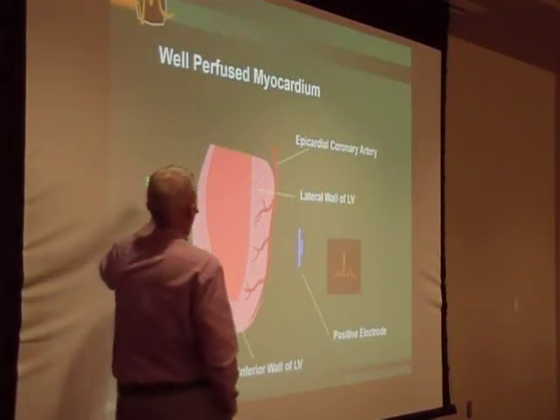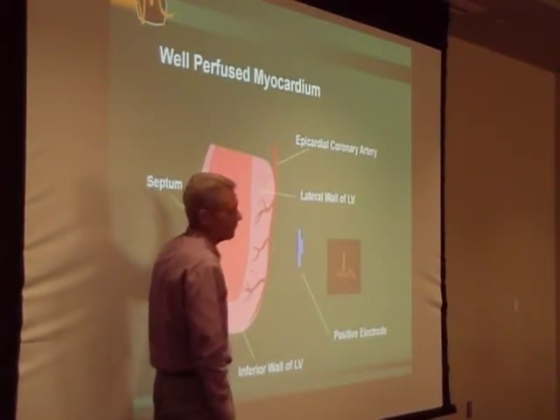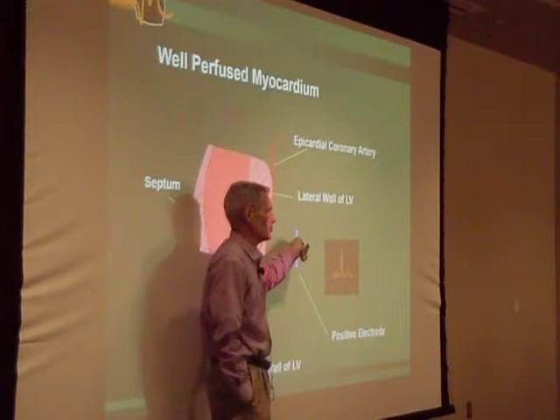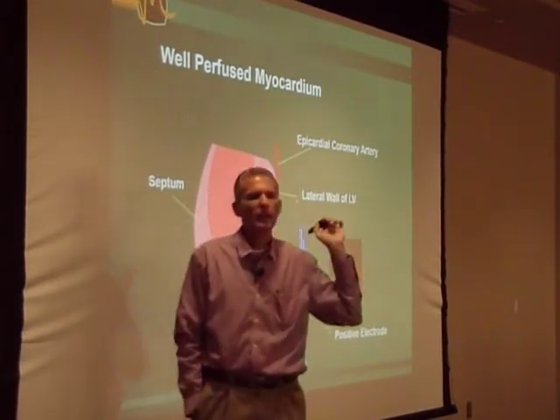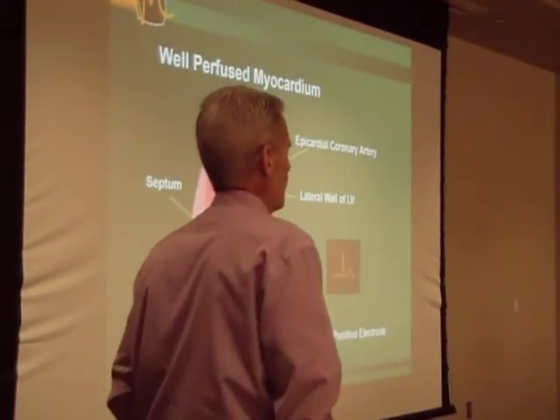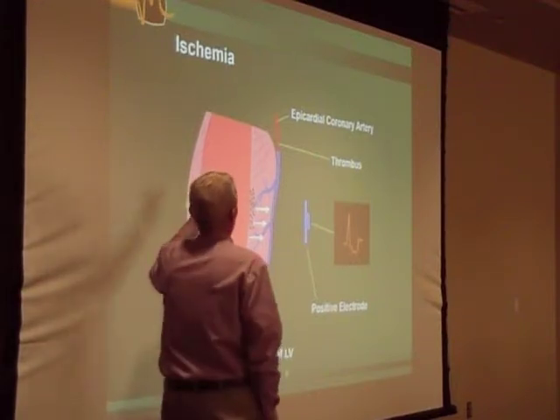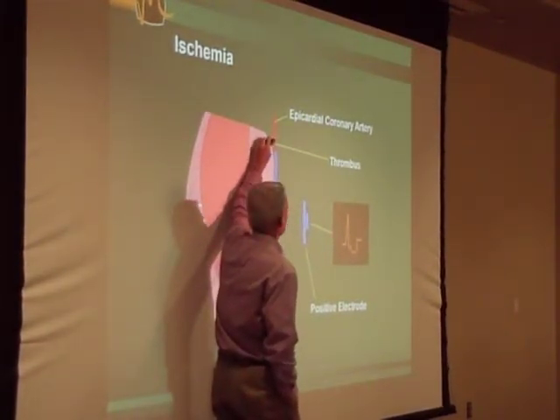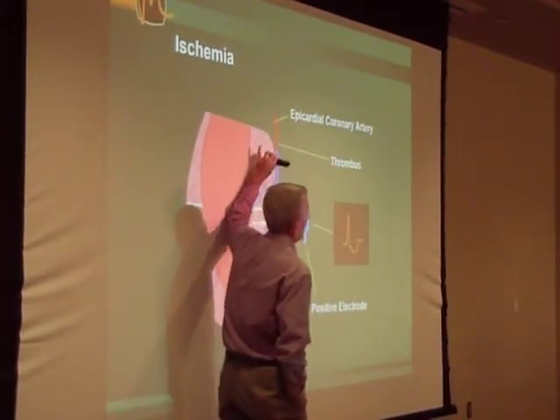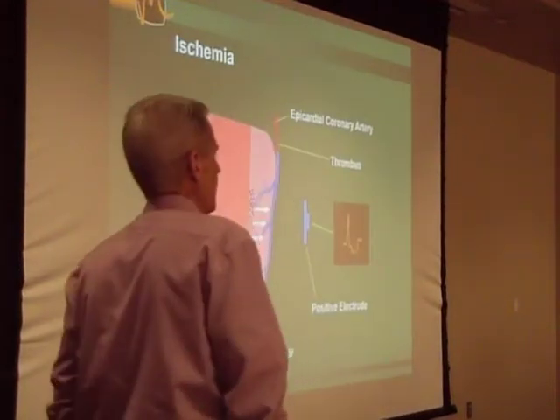So if we had looked at a cutaway of the left ventricle, and let's say everything's working as it should, everything's working fine, you got good blood flow, good electrical signal, we're relying on a skin sensor placed on our patient's chest or arms, looking in at the activity, and if electrically everything is good, your EKG looks phenomenal, nothing wrong. Now let's change that scenario. We have a plaque rupture, we have thrombus that's beginning to form, and we have vasoconstriction. Now, everything distal to that site, I've got colored blue, which means there's a lack of blood delivery and oxygen delivery.